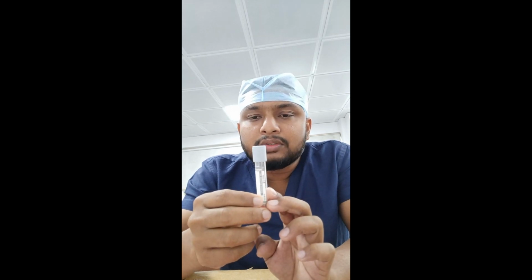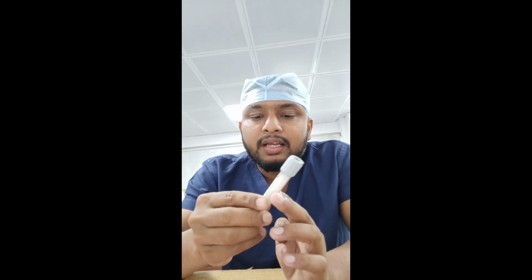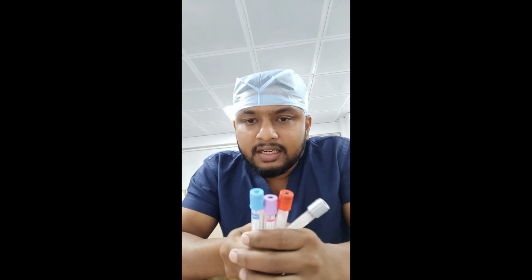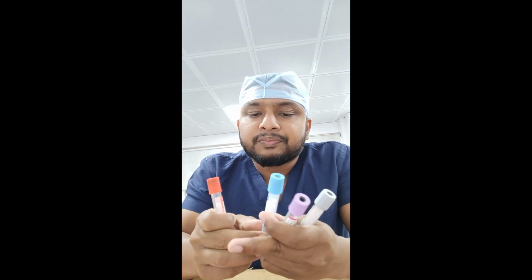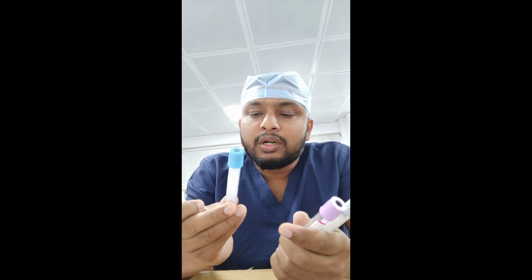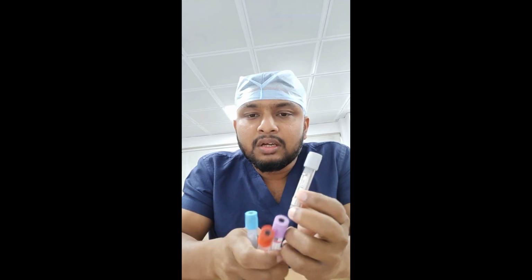And next you have the ash color container, that is sodium fluoride. This is the glucose container. If you want to test fasting blood glucose levels, FBS, you need to send the sample in this color container. You need 2 to 3 ml of blood in this container. After taking, you need to mix well. So these are the commonly used blood Vaccutainers you will see in the clinical setting, in day-to-day practice. Red is for plain biochemistry and serology mainly. This is sodium citrate for coagulation profile. This is the CBP container, and HbA1c also. This is the glucose container.